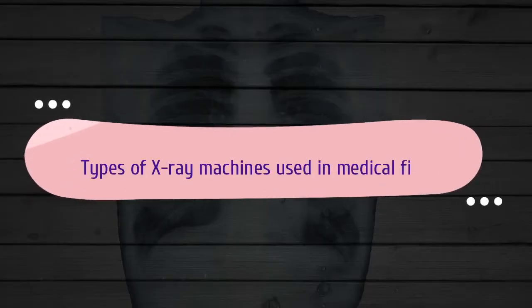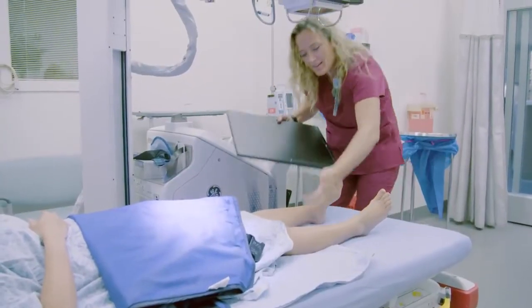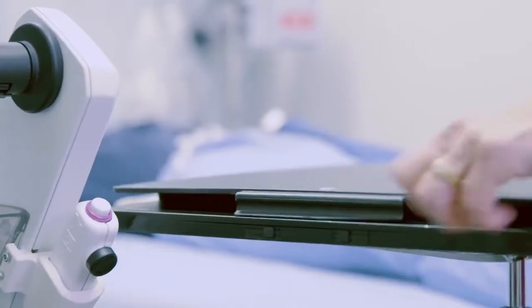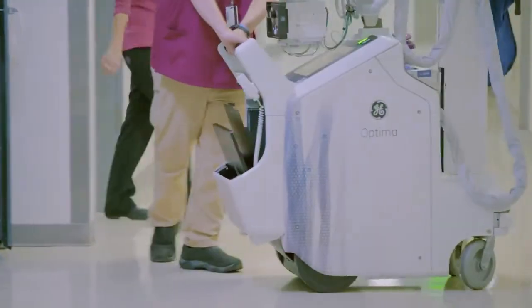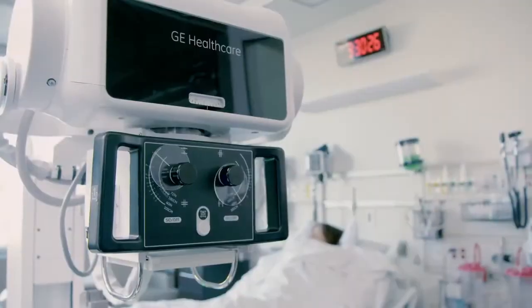Let's get to know some types of X-ray machines used in the medical field. Conventional radiology. This type of traditional X-ray produces a single two-dimensional image, which you have probably seen in an actual doctor's office, if not on a medical TV show or movie. Conventional radiology is primarily used for viewing bones, bone fractures, tissues dense in calcium, dental X-rays, and the chest. Because they are on conventional film, the doctor and patient must wait for the results. Today's digital images, like those produced by our digital cameras, are processed by a computer, so they can be viewed immediately. As a result, they are slowly replacing film.